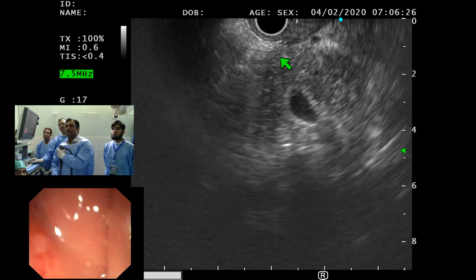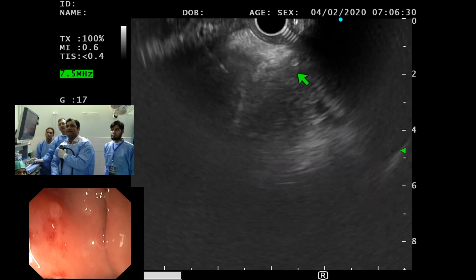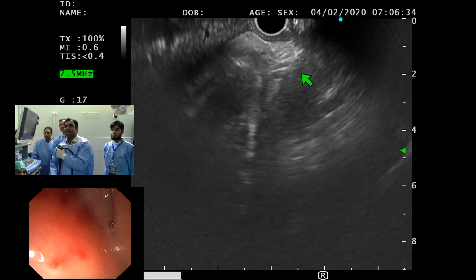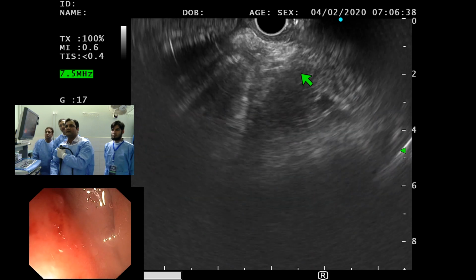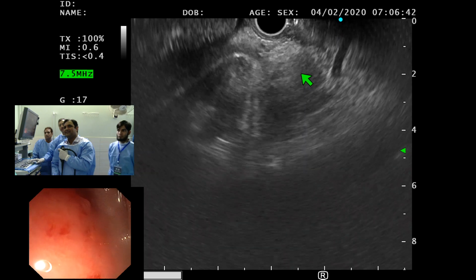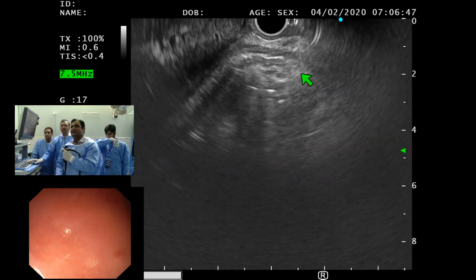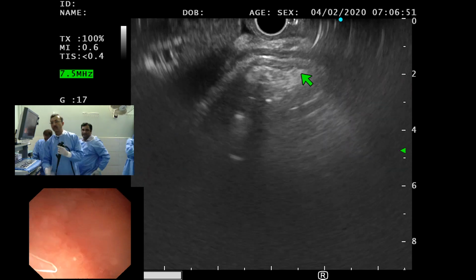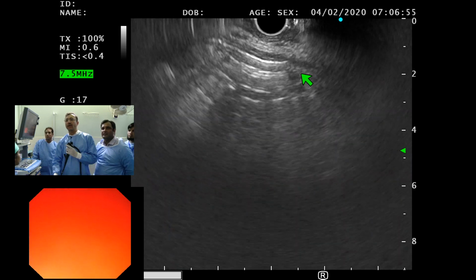Yes, maybe. But then you need to visualize it better. Yes, we've got another 10 cases to do. Okay. Yeah, this is a stent.